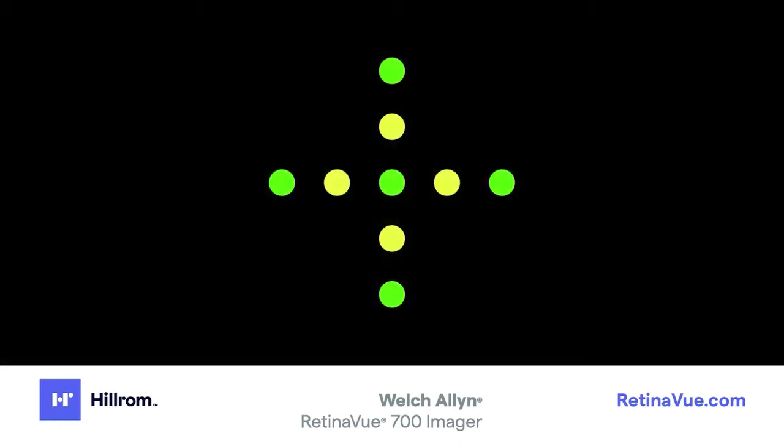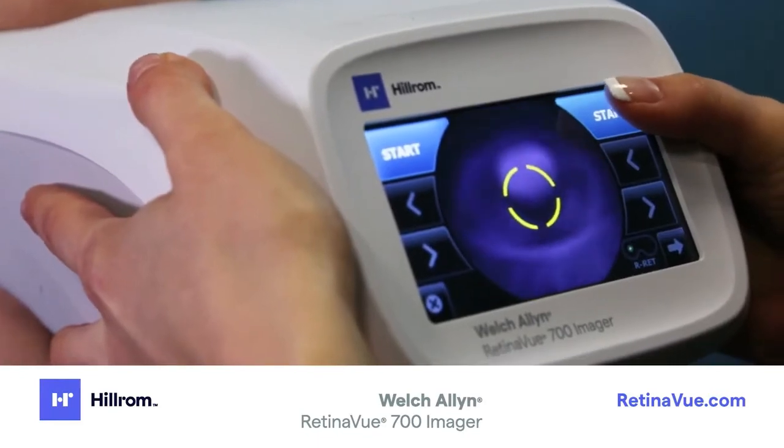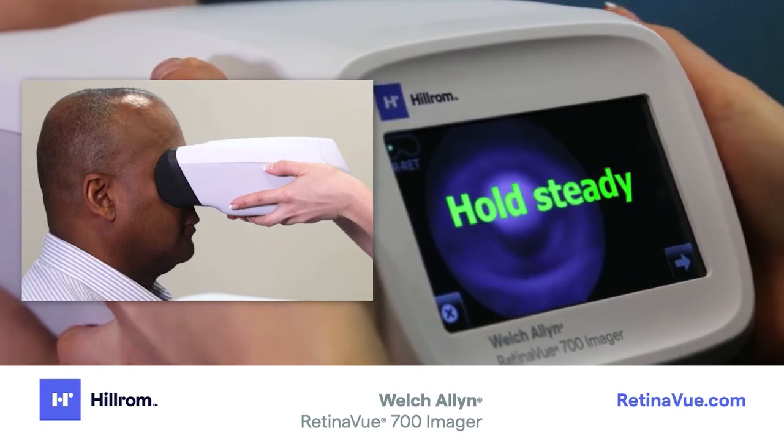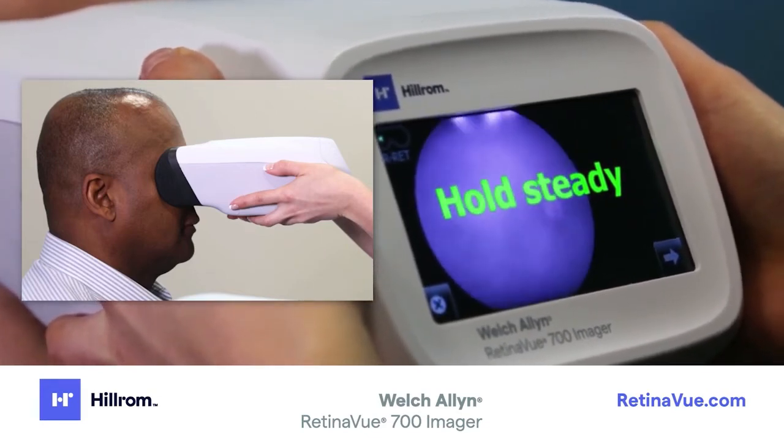The patient will see green and yellow dots in the shape of a plus sign. Confirm the patient can see the entire plus sign, and tell the patient the plus sign will transition into a green dot — ask the patient to follow the green dot. Use your thumb to touch Start and hold the imager steady while keeping it pressed securely on the patient's face.